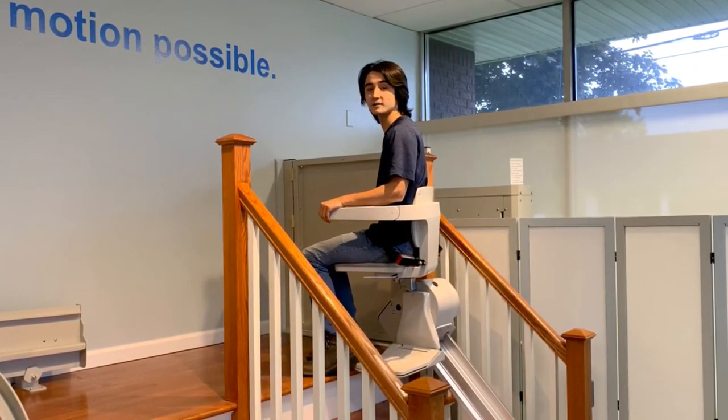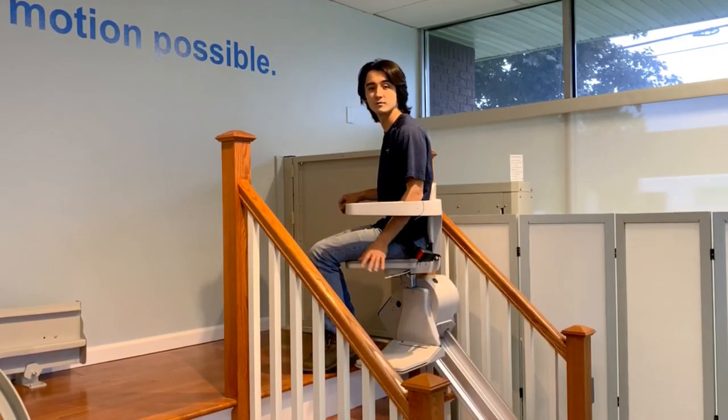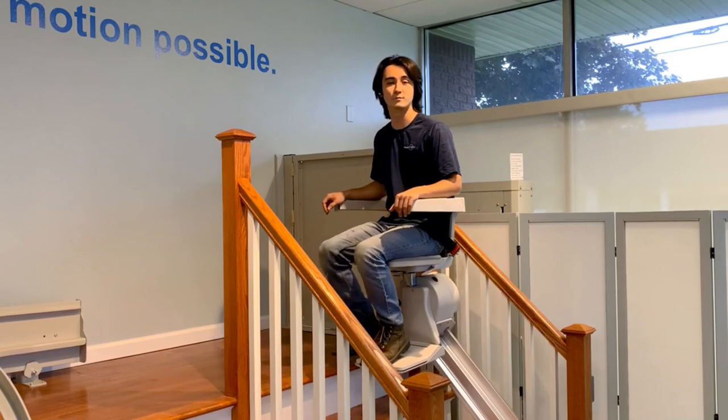To swivel back into the riding position, push down the lever, use your legs to swivel, let go, and the chair will lock into the riding position.